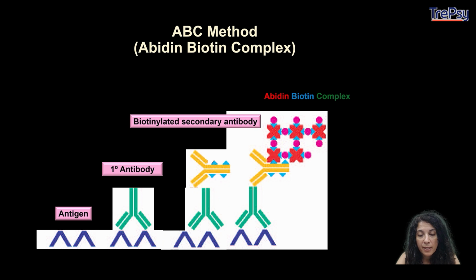Then finally we have the ABC method, avidin-biotin complex. This complex is very important to amplify my reaction. How can I do that?